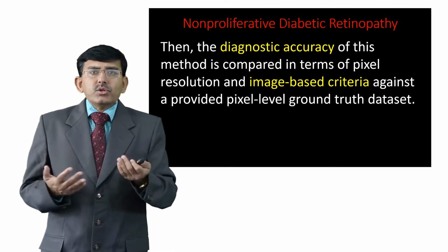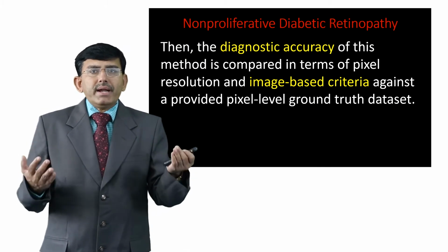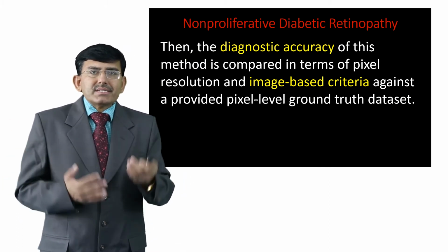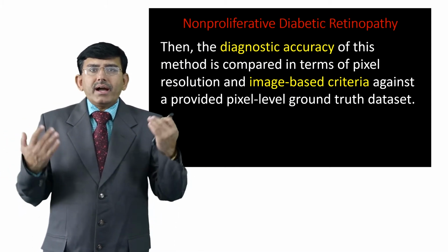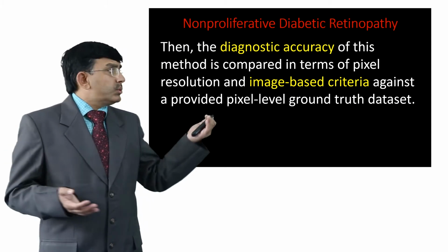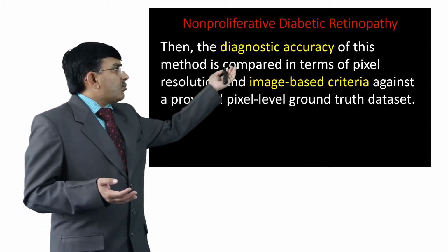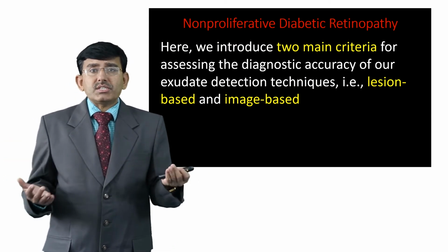Then the diagnostic accuracy of this method is compared in terms of pixel resolution and image based criteria against a provided pixel level ground truth data set, which is openly available for the purpose of verification.